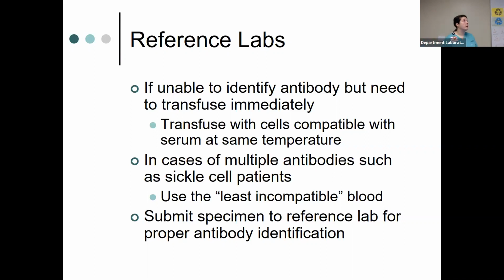Keep in mind your methodology of testing. Here at UAMS, we use the gel technology, which you guys will get to see next week. A lot of times we would have some non-specific reactions with our patient plasma, and then we would forward it to the reference lab for them to help us ID it. They use the tube method, what you guys have been doing and are going to do today for your IAT, and so they would not pick up the reactions that we're picking up. So gel is a little bit more sensitive.